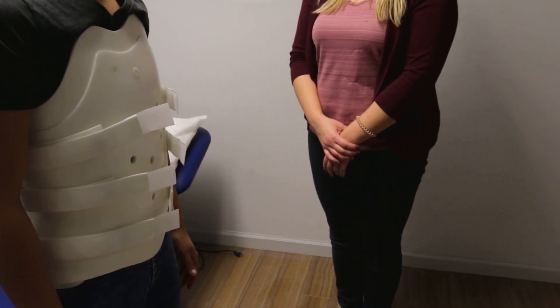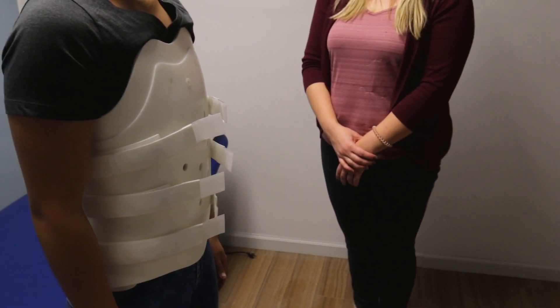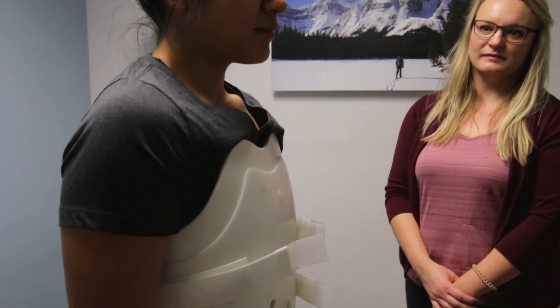It's going to be quite snug and you'll feel the tightness in your breathing, but this is the amount of stability that you're going to need for your spinal fracture. Thank you.